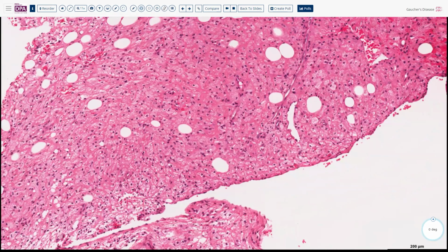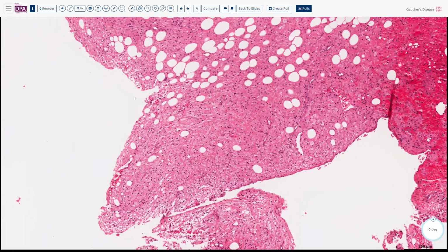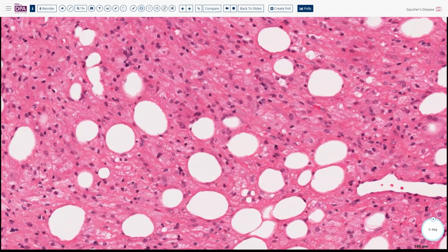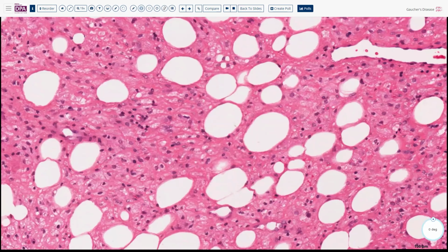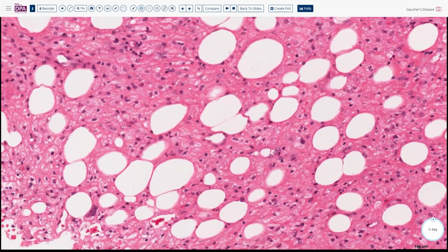Additionally, with Langerhans histiocytosis, we might expect to see more eosinophils. I mean, it isn't called eosinophilic granuloma for nothing. We might consider various infectious processes, things like Whipple's disease or other granulomatous type of infectious or inflammatory processes.